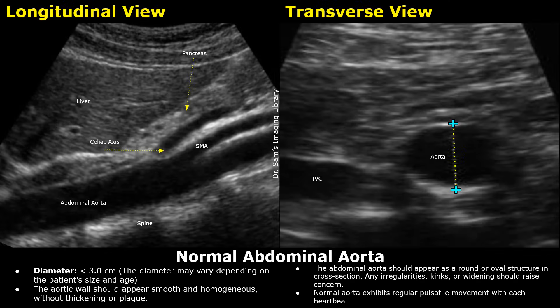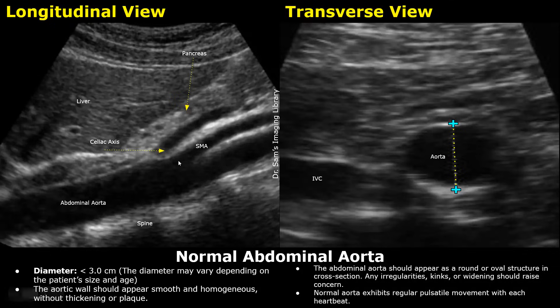Hello everyone, this is Dr. Sam, and this video is about abdominal aorta ultrasound. In these ultrasound images, we see the normal aorta in longitudinal and transverse planes. In the longitudinal image, this anechoic tubular structure is the aorta. We can also see two branches arising from it. The first branch is the celiac axis, and the second branch is the superior mesenteric artery.